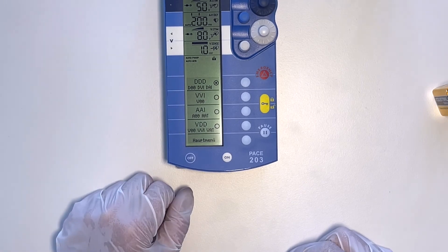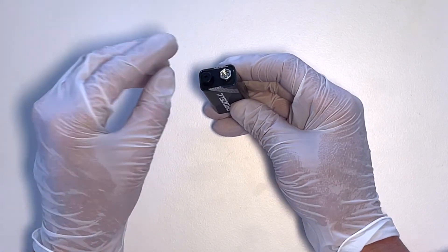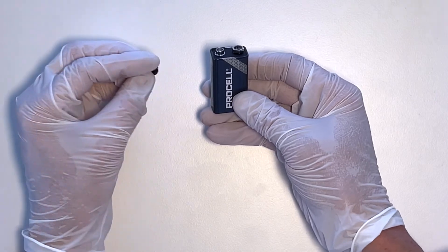Be aware that some batteries have a little plastic cap on them that needs to be removed before you put the new battery in.